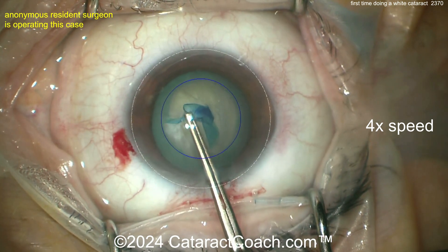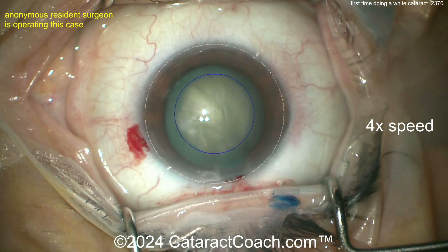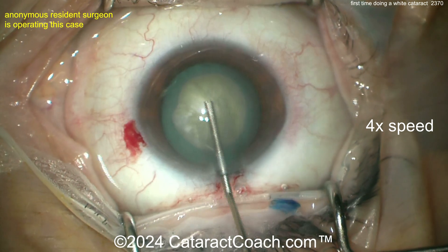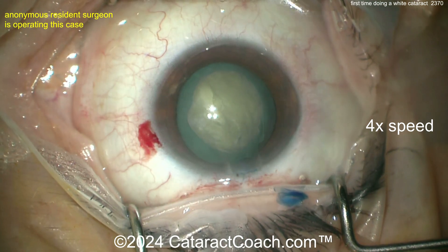Fortunately for this resident — nice tracing of that — it allows you to make a pretty good-looking rhexis. I'll take it. Now probably for the rest of the surgery you may want to turn off that overlay — there you go.